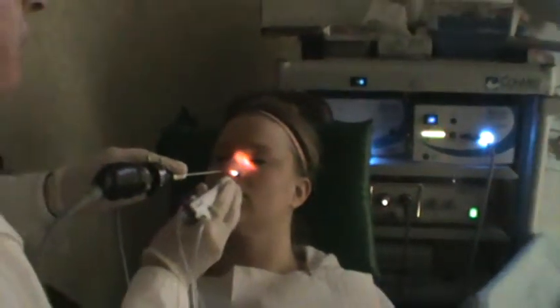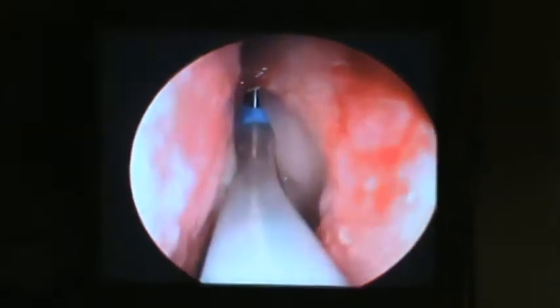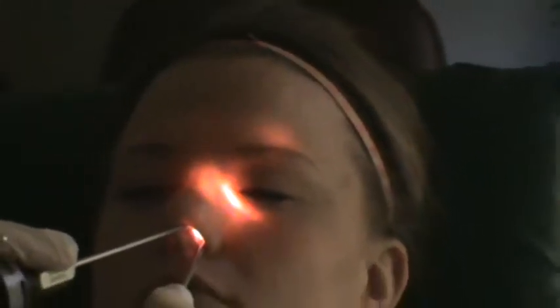We're going to pass the guide right up towards your left eye. We're going to look for the light to shine up by your eye — you can see it right up in your forehead there. You're going to feel a little pressure now as I advance the balloon up towards your eye on the left side. Left forehead, left eye, okay?